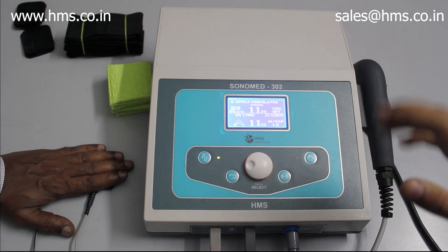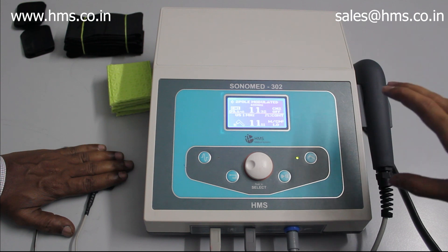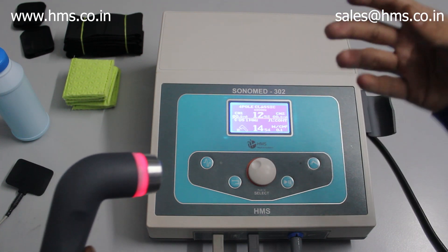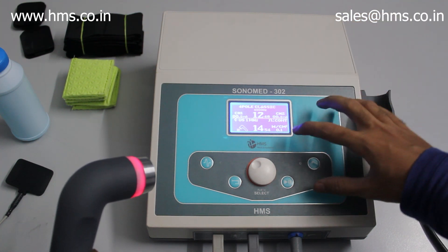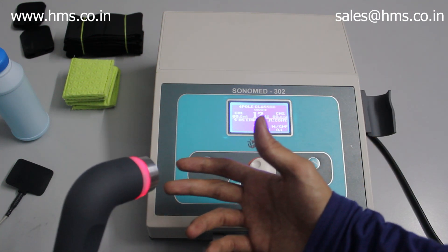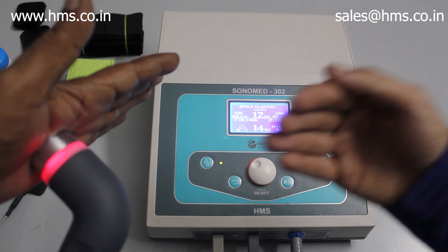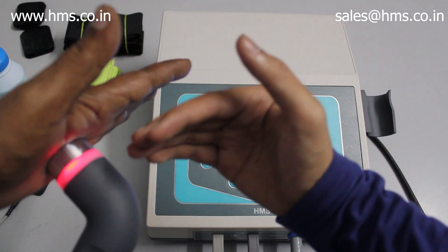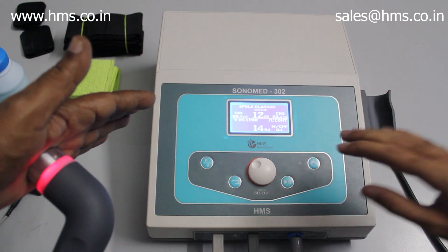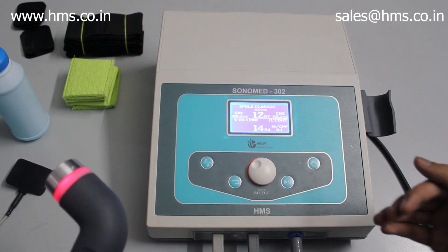This sensing feature is exclusive to HMS products and is available with all electrotherapy equipment from HMS. The sensing feature also works for ultrasound therapy. As demonstrated, when there is no contact between the transducer and the skin, the machine stops treatment and starts beeping. Even when the transducer is placed on the skin without sufficient gel between the transducer and the body, the treatment will not start and the output will not come.